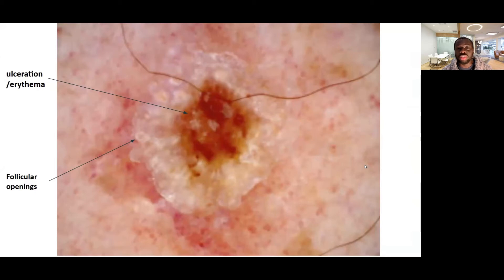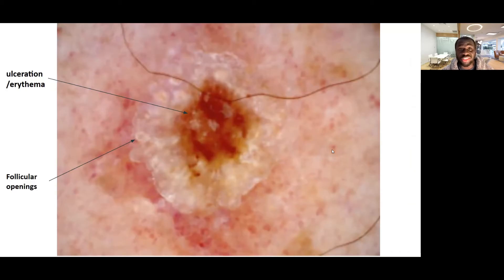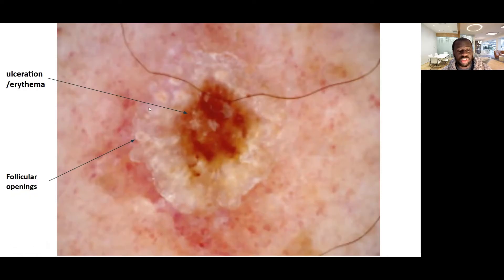Looking at this lesion on dermoscopy, you can see this area of hyperemia or redness. This would also be an area of ulceration. Depending on how this lesion appears grossly — before you place your dermoscope — is there an ulcer? There's no ulcer. This is obviously an area of erythema, redness. You could see this area of whitish around this erythema or hyperemia. You could see follicular openings, which are usually yellowish and look like areas of fatty lipid deposits, but they're follicular openings.